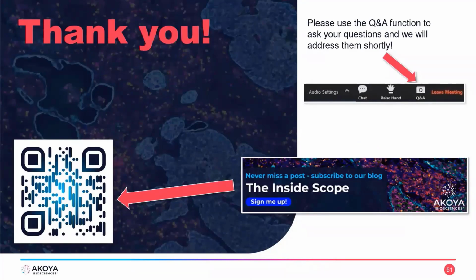Okay, perfect. So Michael, could you maybe fill in a gap a little bit more on the removal step? How exactly do we remove the simulated H&E prior to multiplexing? Yeah, I just wanted to quickly chime in on that. It's actually done via AR methods that you would use normally. So there's not necessarily an extra step. It's what you would ordinarily do with the FFPE tissue section prior to MIF staining anyway.